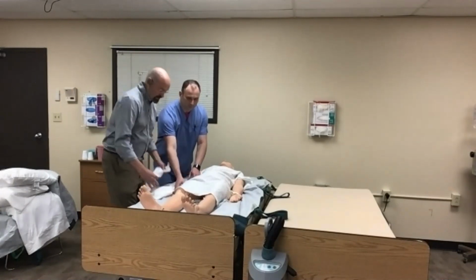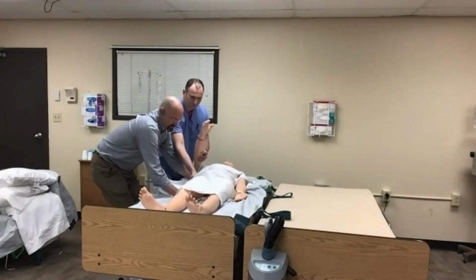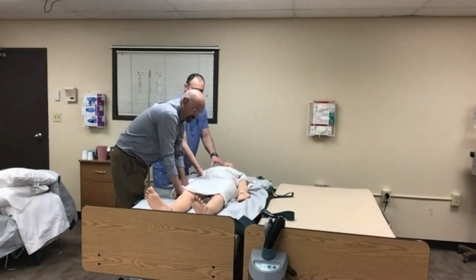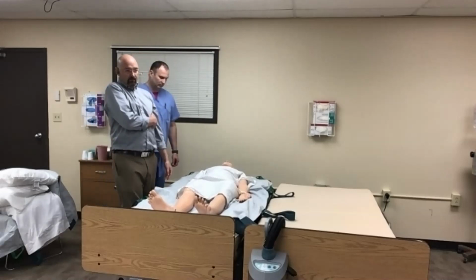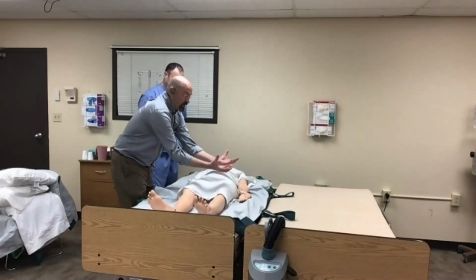What this does, by tucking the pillowcase underneath his body just a couple of inches, laying the arm and all the tubing in place, and then retucking this under his body, is physically lock that arm in place. Otherwise, the person on this side would see that arm flop under and land under the patient. So usually somebody has to physically hold that and then have the patient land on their arms.